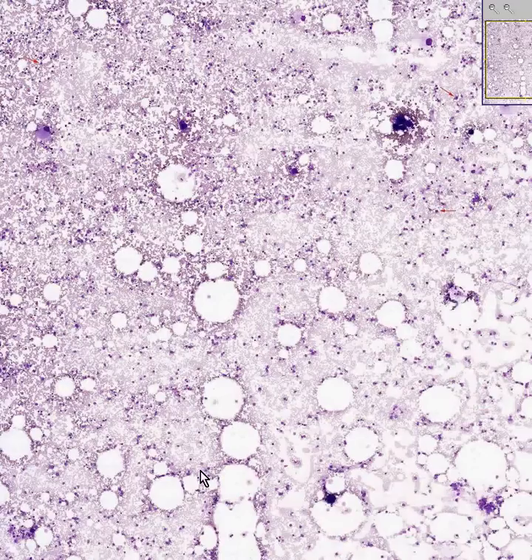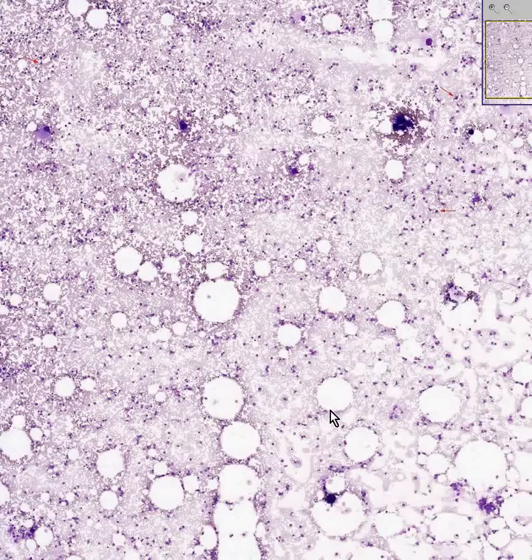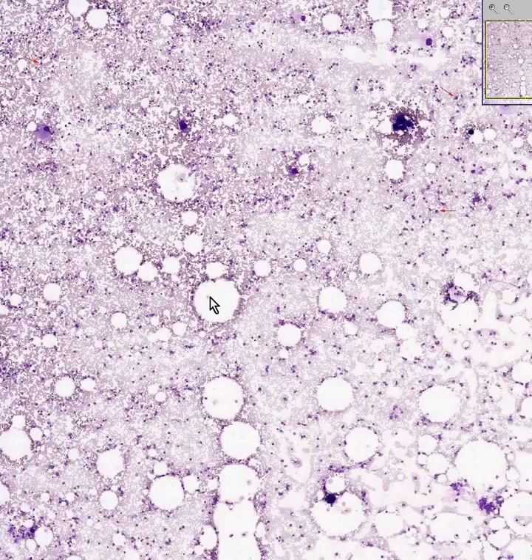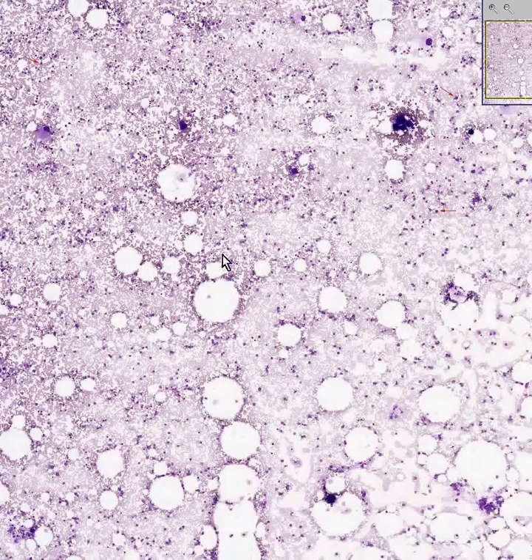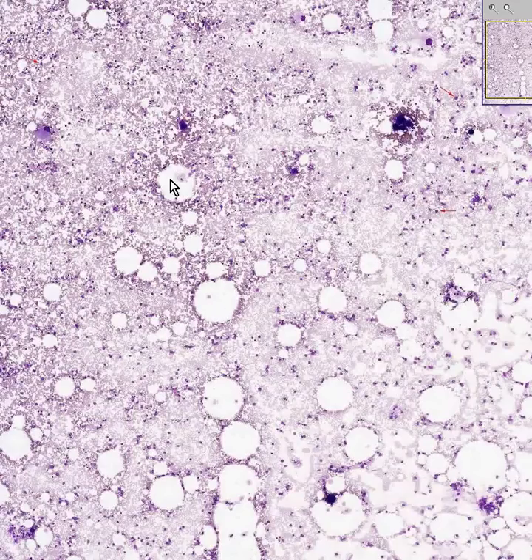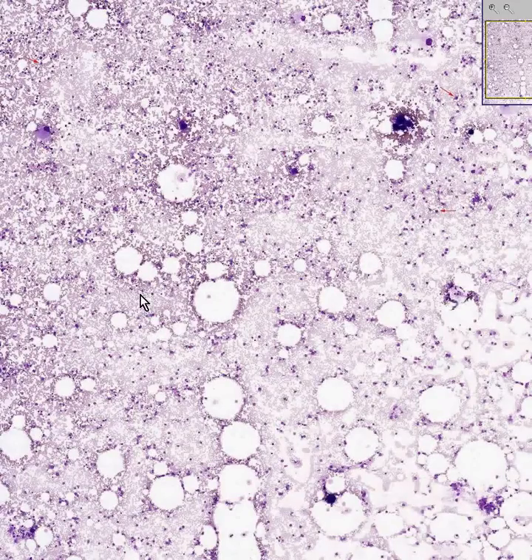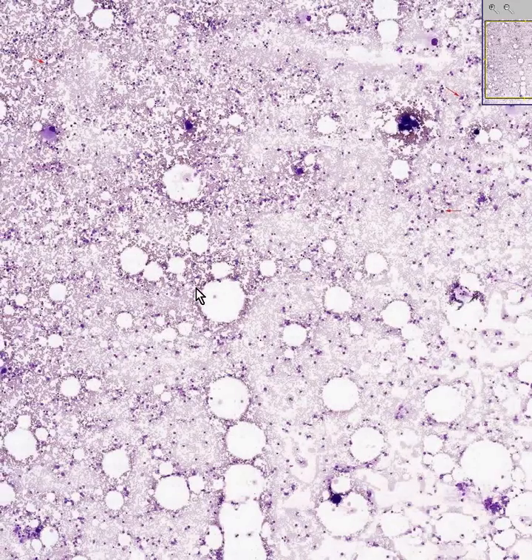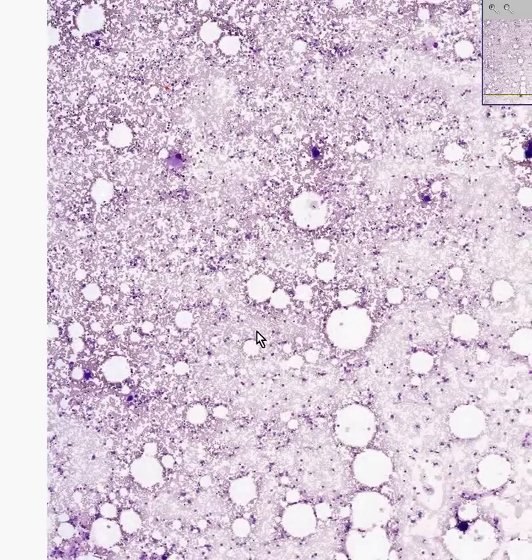This is a smear of a person's bone marrow. The white round areas are probably areas of fat, and just like we see in tissue sections, round, fairly distinct lobular areas usually represent fat, because the bone marrow is largely fat.